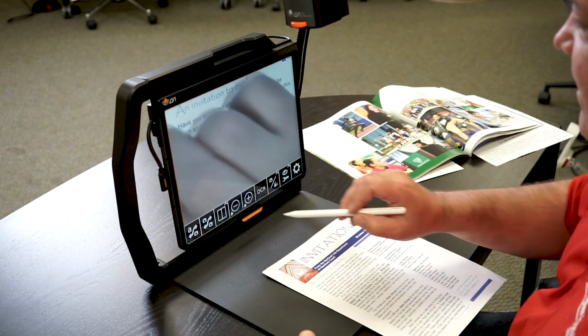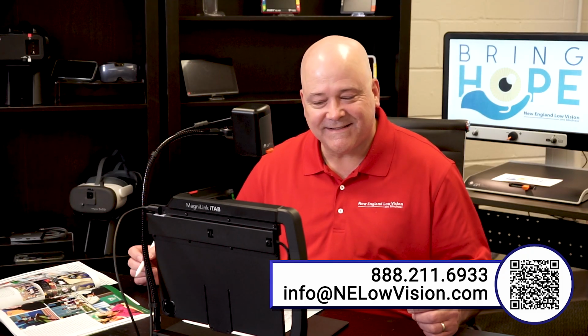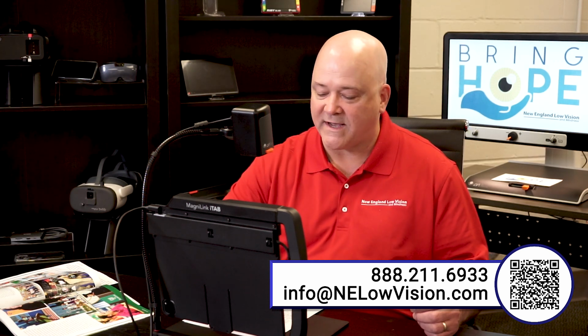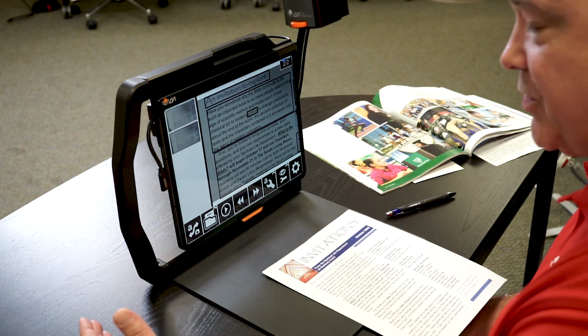We're gonna go back here. We're gonna rescan that in. New voice, new speed, new volume. We're gonna pause it there. We're gonna make it bigger, okay? You can always change the backgrounds as I showed you earlier.